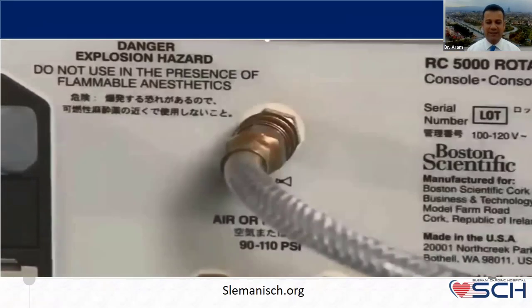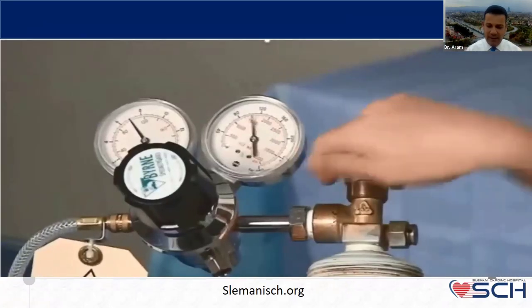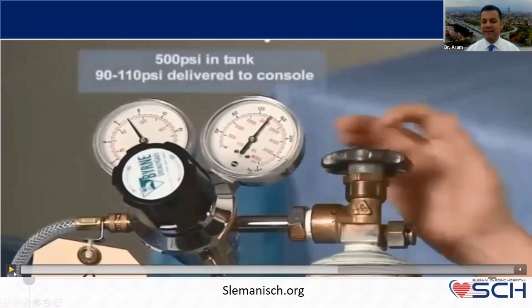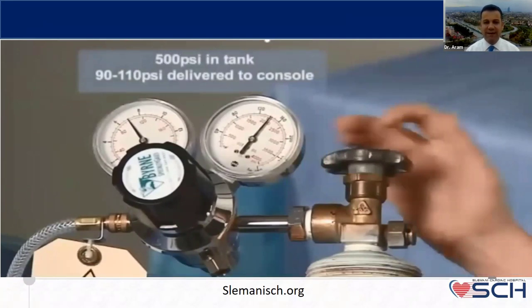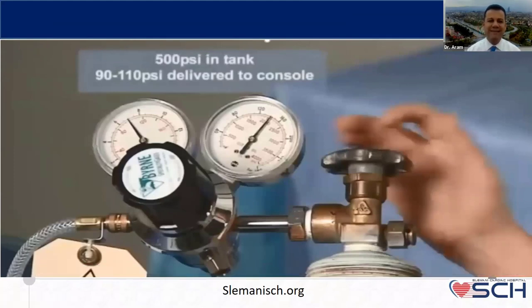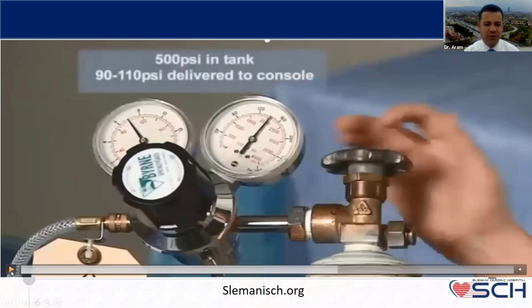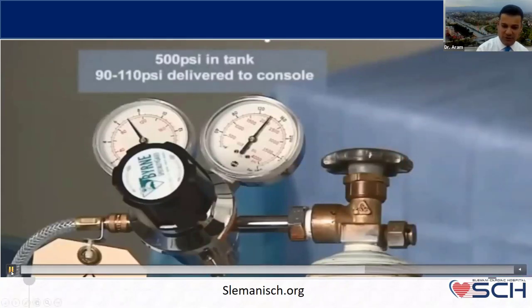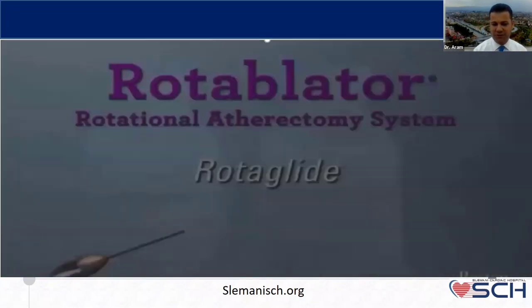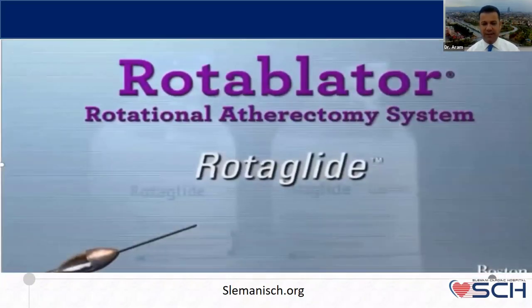As we say, the console is the hardware of the machine. The gas tank should have at least 500 psi, and about 90 to 110 psi should be delivered to the system through the special port. Later on, we are going to attach this to the console.